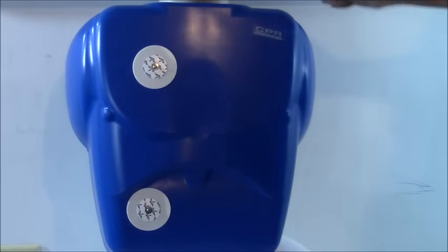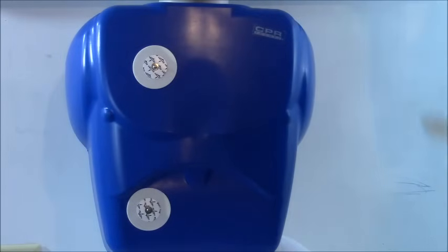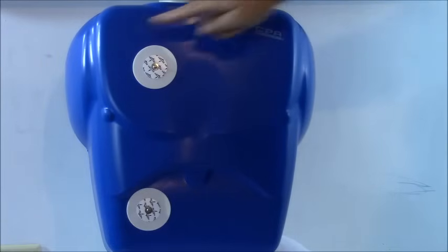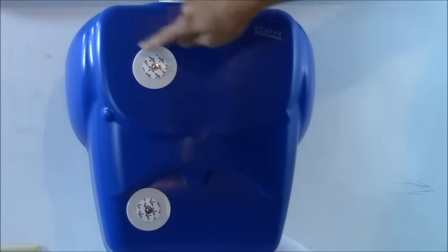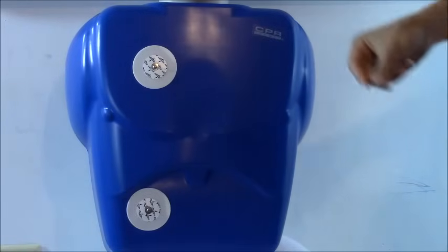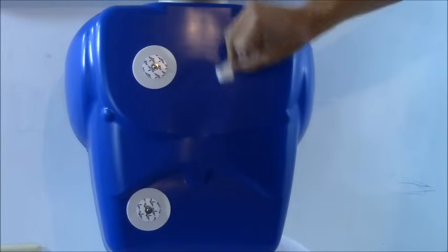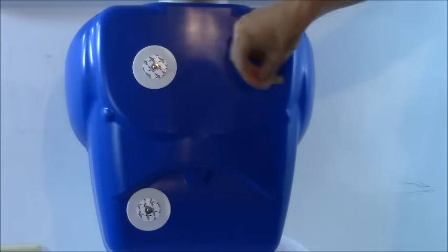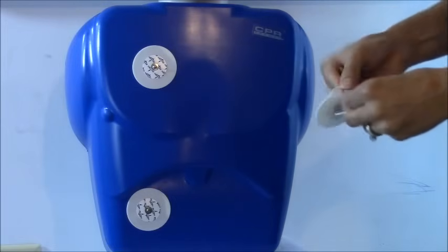And then let's do our left arm leads. We have left arm and lower leg. So what we'll do is we'll prep for that. And remember, watch out for any pacemakers, implanted devices. You can sometimes have sub-Q ports or even pacemakers over here and you never want to put your electrode over that. So you'll want to go away from that. So you'll clean the skin right here. It's the second intercostal space on the left side of the body. It's literally right across from your right arm lead. And you'll just take your backing off, put it on.